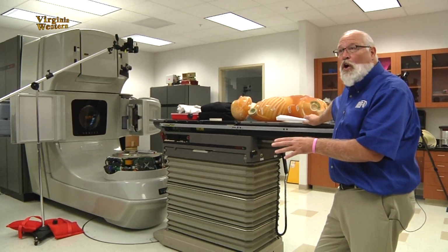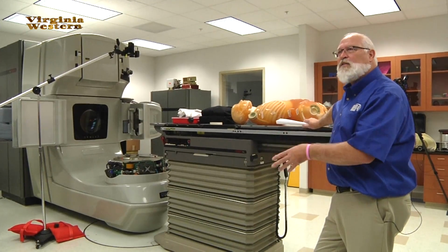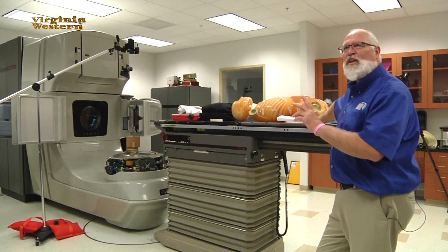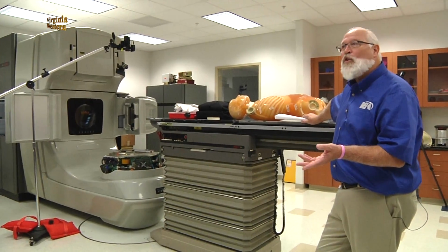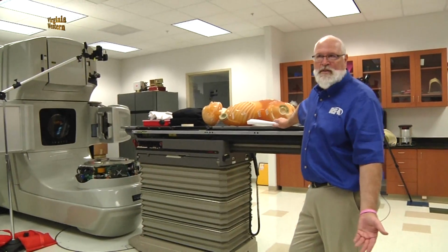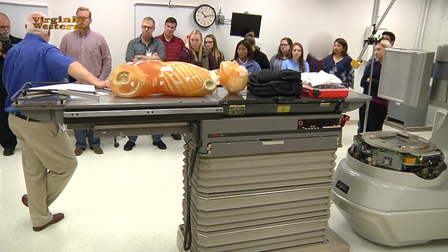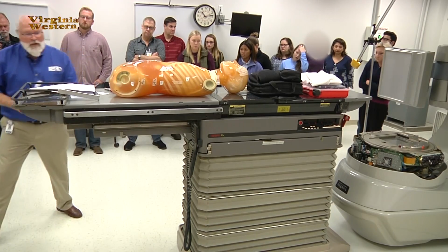Your manager will call the physicist and say, this is what the Varian engineer did, and usually he'll get a copy of our service report so we can look at it. Most of your engineers will call the physicist or your department manager and tell them or text them what needs to be done before you can use the system for treatment. Okay?